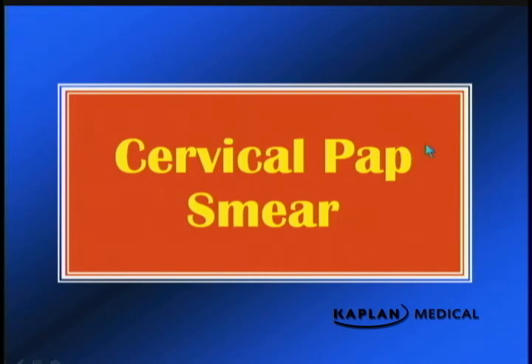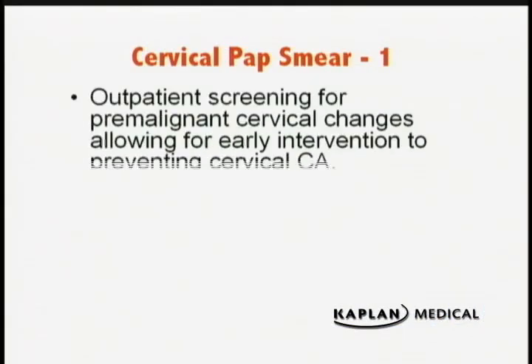All right, the next procedure we'll look at is the cervical pap smear. Now, we'll talk more about this in the chapter on cervical neoplasia. A cervical pap smear is an outpatient screening procedure for premalignant cervical changes, allowing for early intervention to prevent cervical cancer.